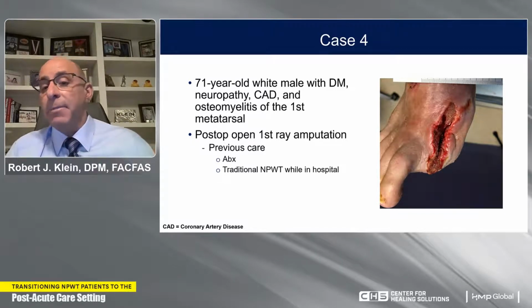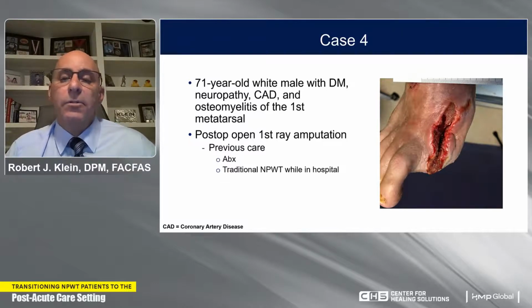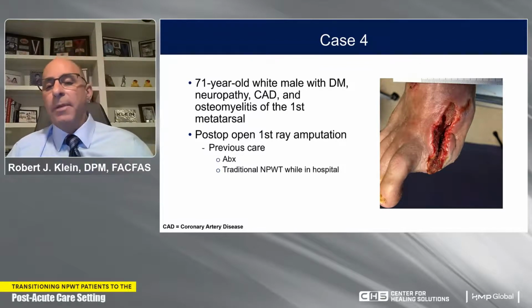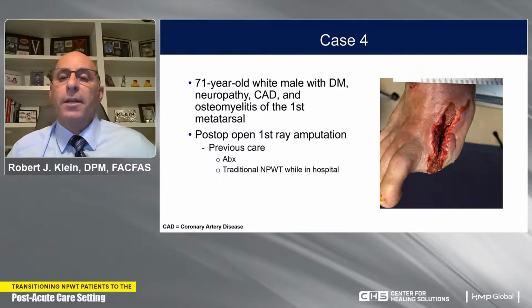This patient was adamant that he did not want to go home with a wound vac. He wanted to be mobile. He wanted to do some things in his life where he was not tethered to a power cord or have to recharge a battery. So we kind of made a deal in the hospital that I would discharge him home, but I would like to use disposable negative pressure wound therapy on him to aid in closure.